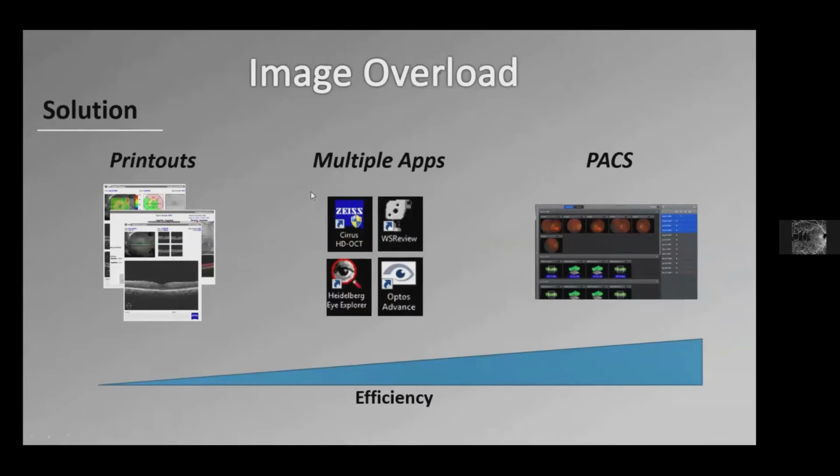Obviously, the upside, as opposed to paper printouts, is that you are able to interact with the images. They typically are of larger size. They're nice, large digital images on a computer monitor. So some benefits over printouts, but certainly still a limited way to review images.